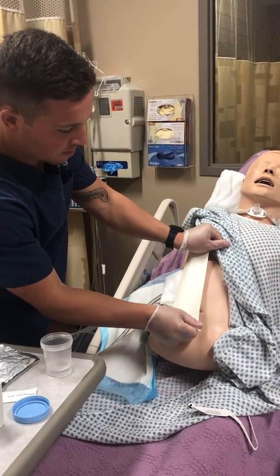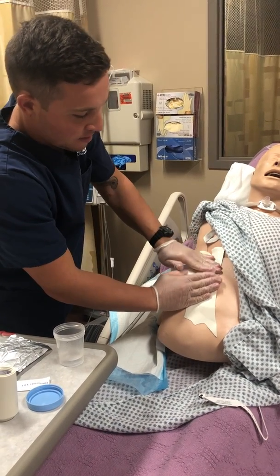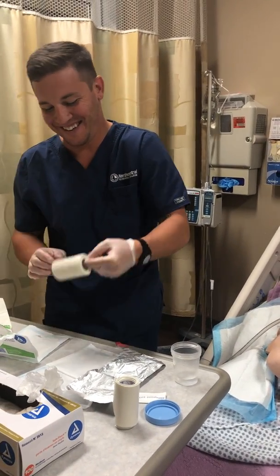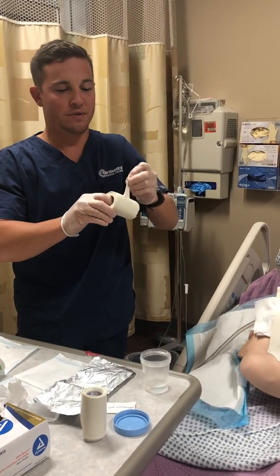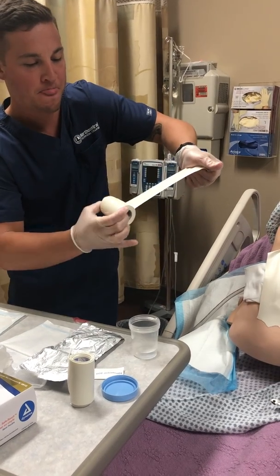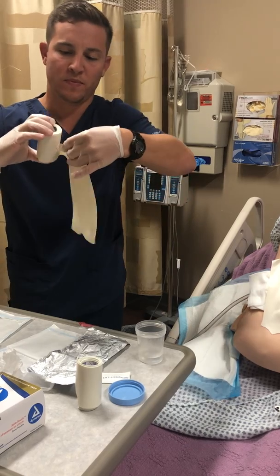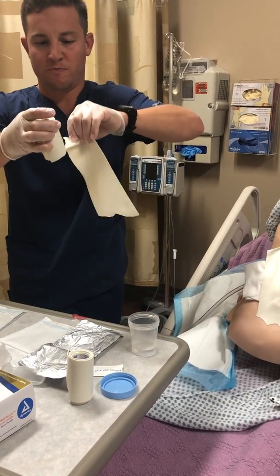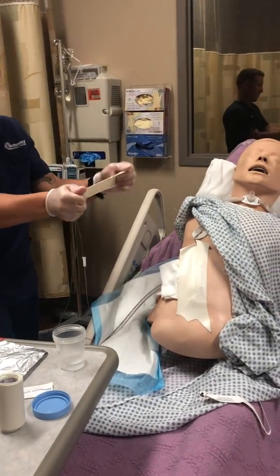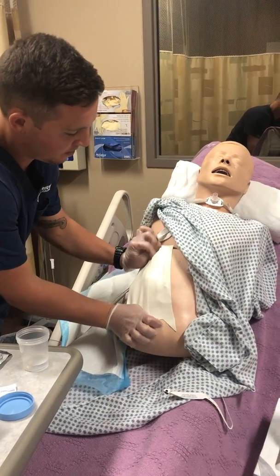I'm going to go across, pressing firmly, like I said, to make an airtight seal. Okay, we're going to do that again, keeping the middle clean. Tear. Pulling tight, going over, overlapping.